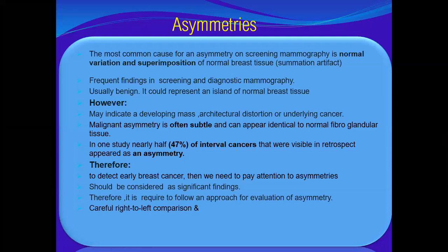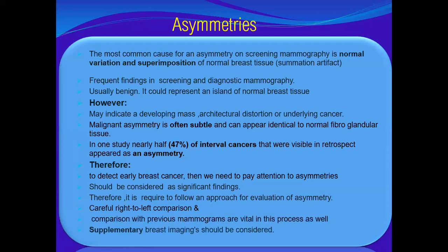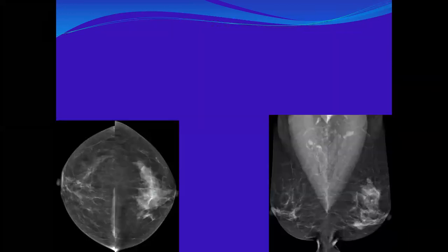Careful right to left comparison and comparison with previous mammograms are vital in this process as well. Supplementary breast imaging should be considered. Okay, what about this, Suhair?